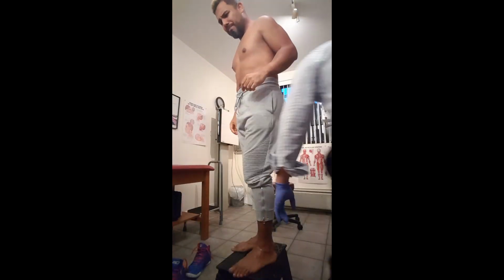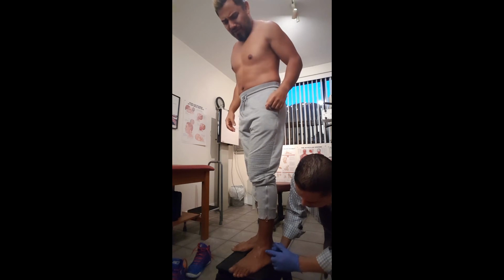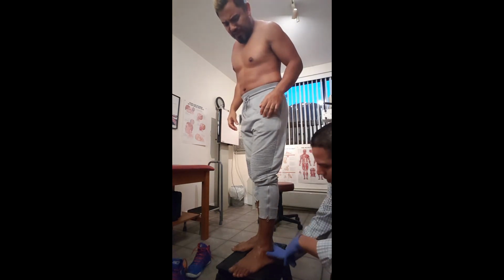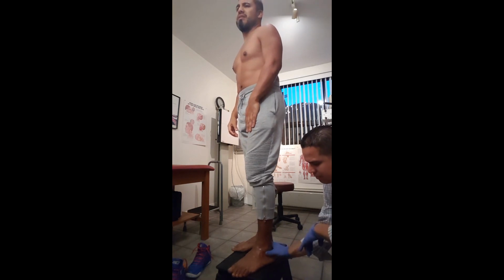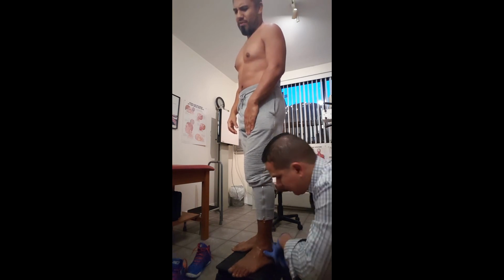Now, some of you may see here, we got a little indentation. That's normal. That's just part of the treatment. So no need to worry about that. This part is just pressure from my finger, right? Pressure from your finger. Yes. Okay. All right. Right there, doctor.